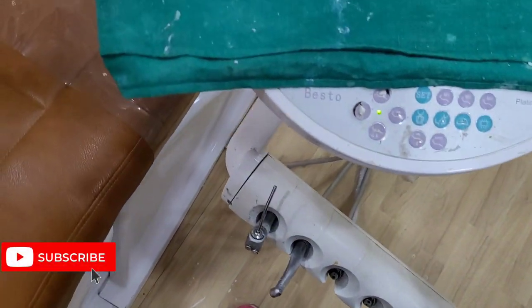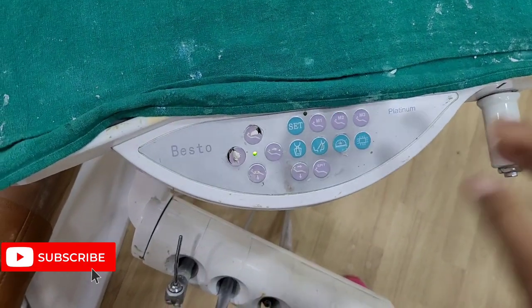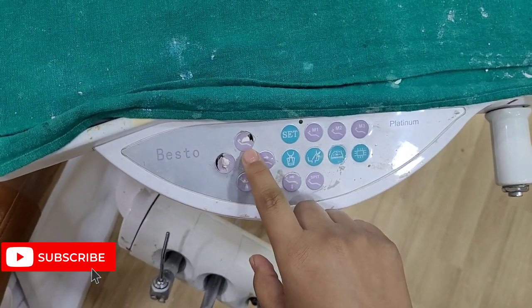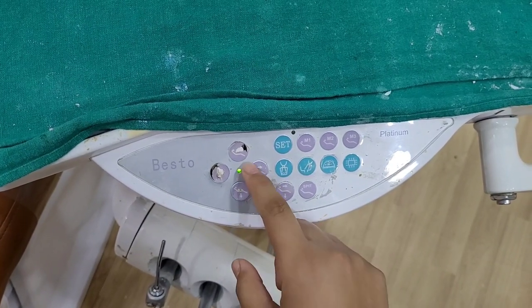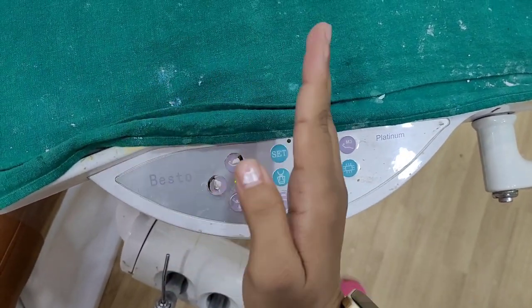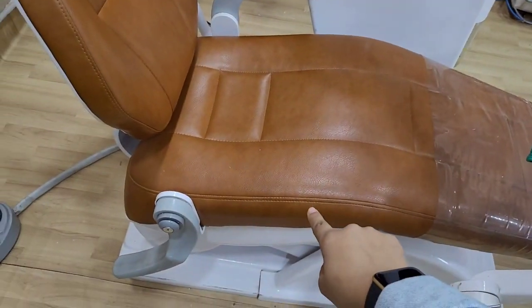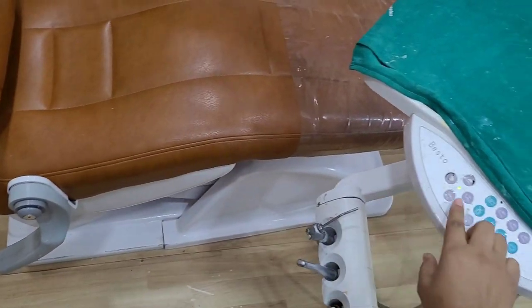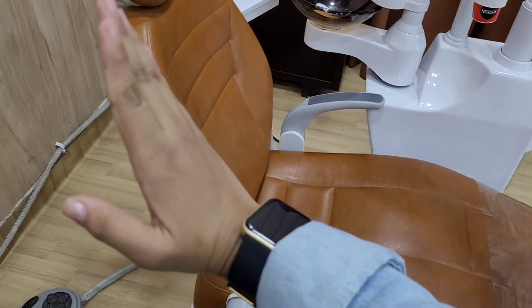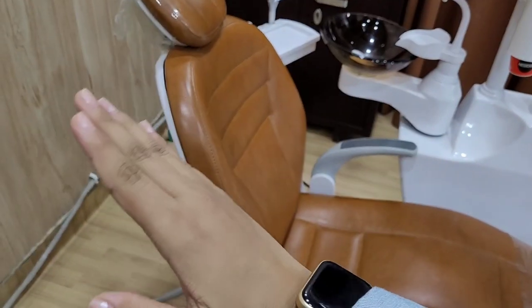Here are the buttons on the chair panel. On the top of the buttons, the functions are also labelled. For example, this button makes the chair go up and this one makes the chair go down. This is the back seat to go up and this is the back seat to go down.